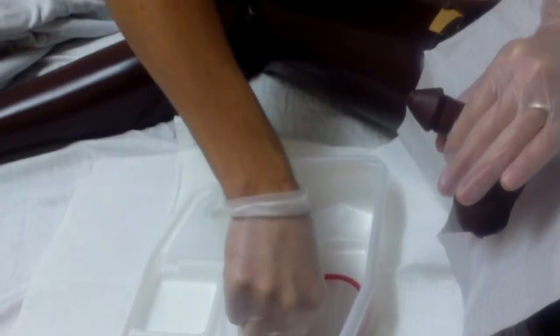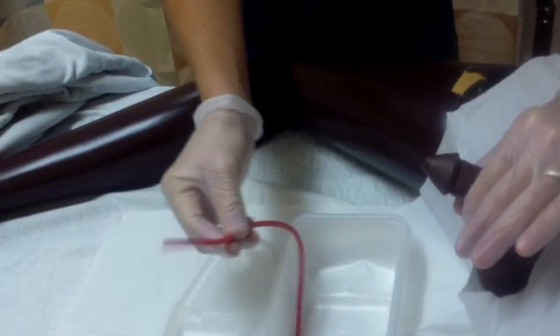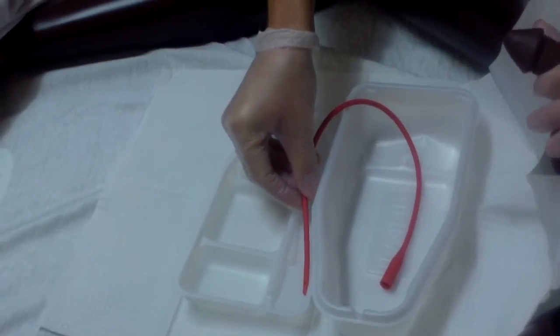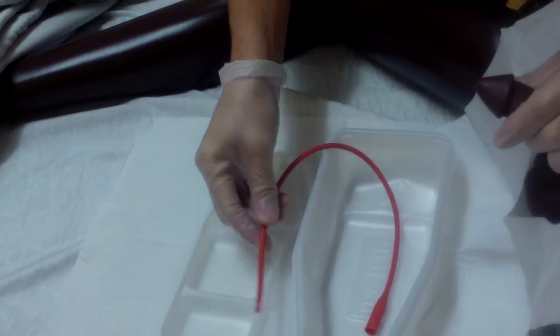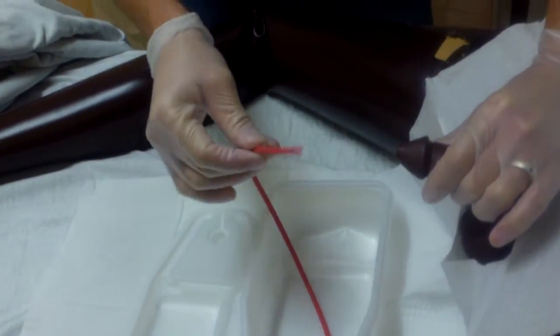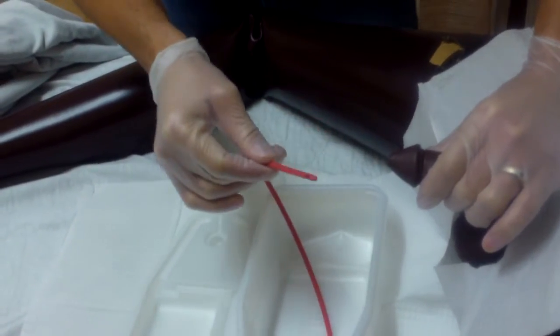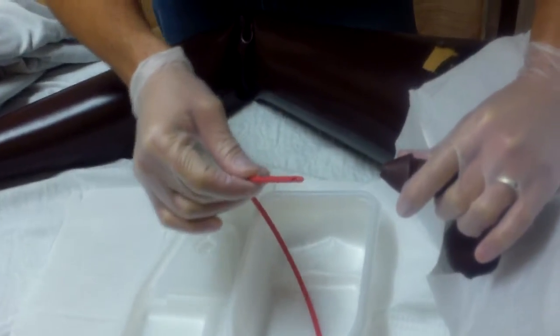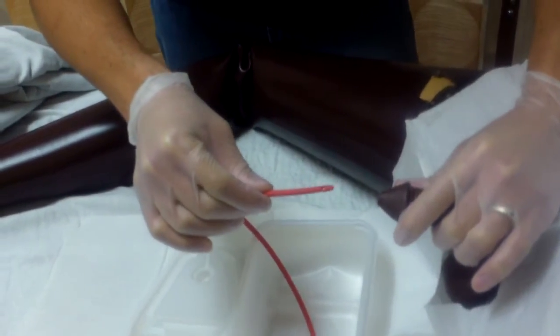And then I would take my catheter, I would roll it in my lubricant. I would then spread the meatus, and then I would ask the patient to bear down because this is not a super pleasant procedure. But then, he's definitely going to need to breathe some for me, and maybe even wiggle his toes.